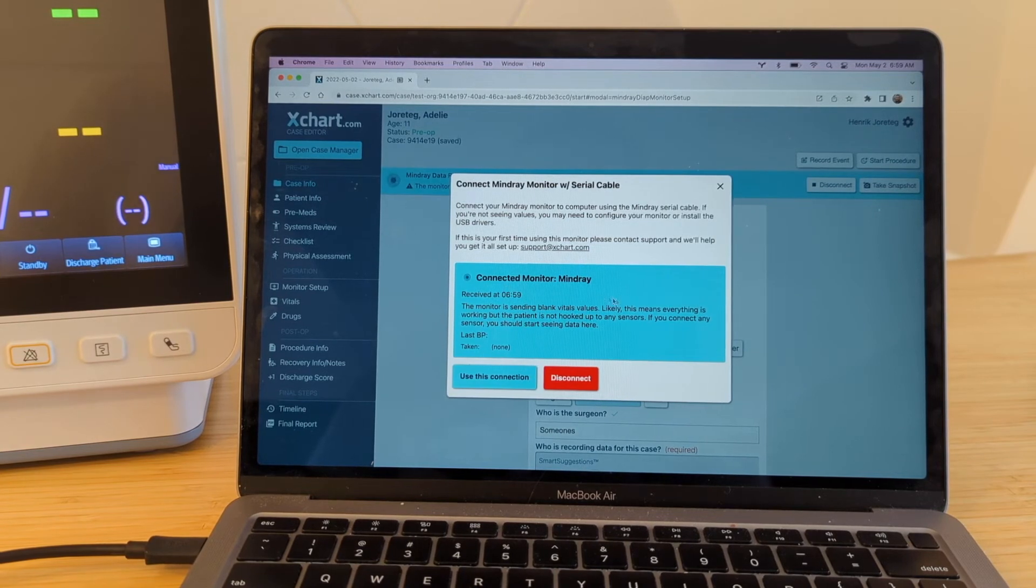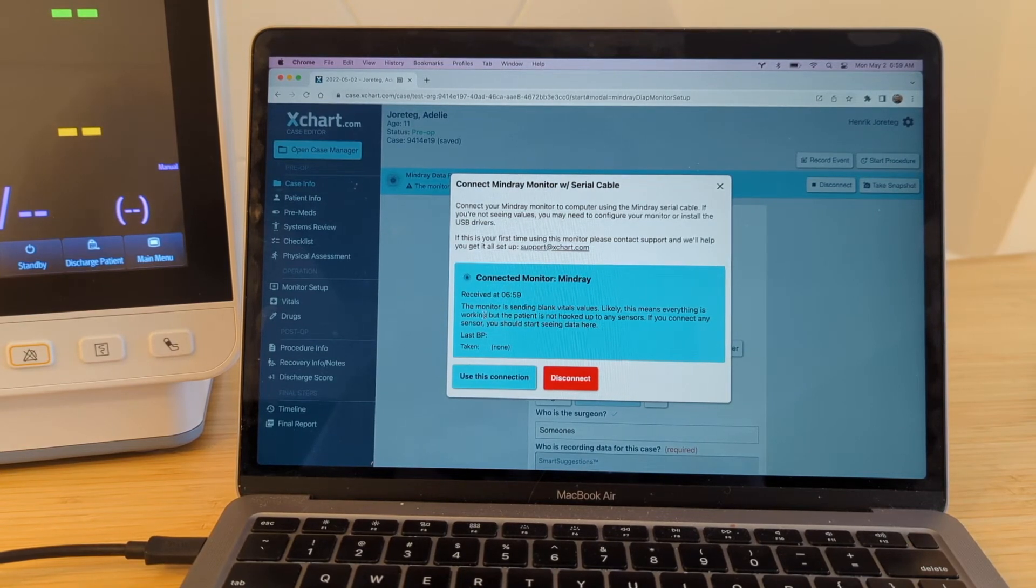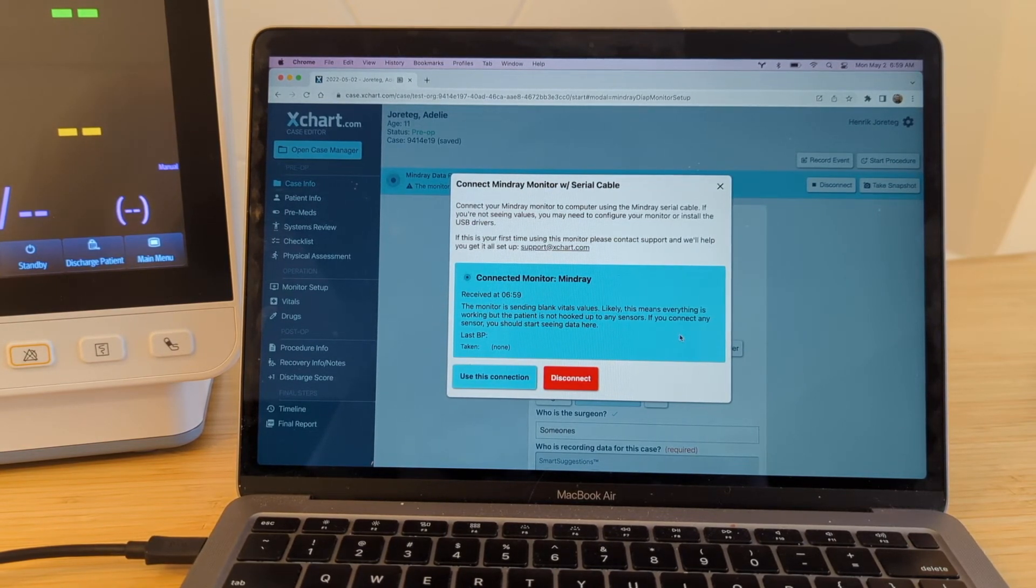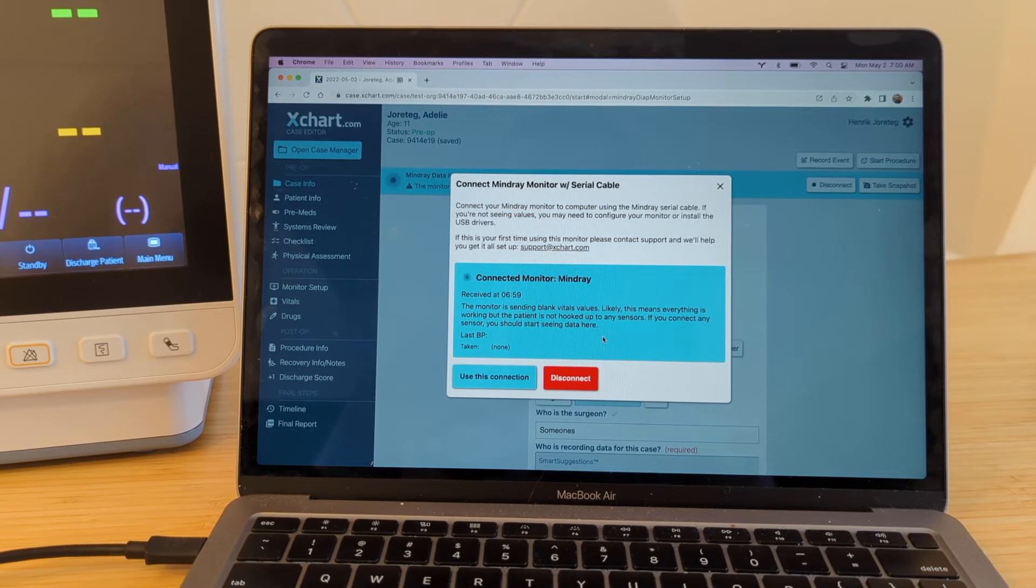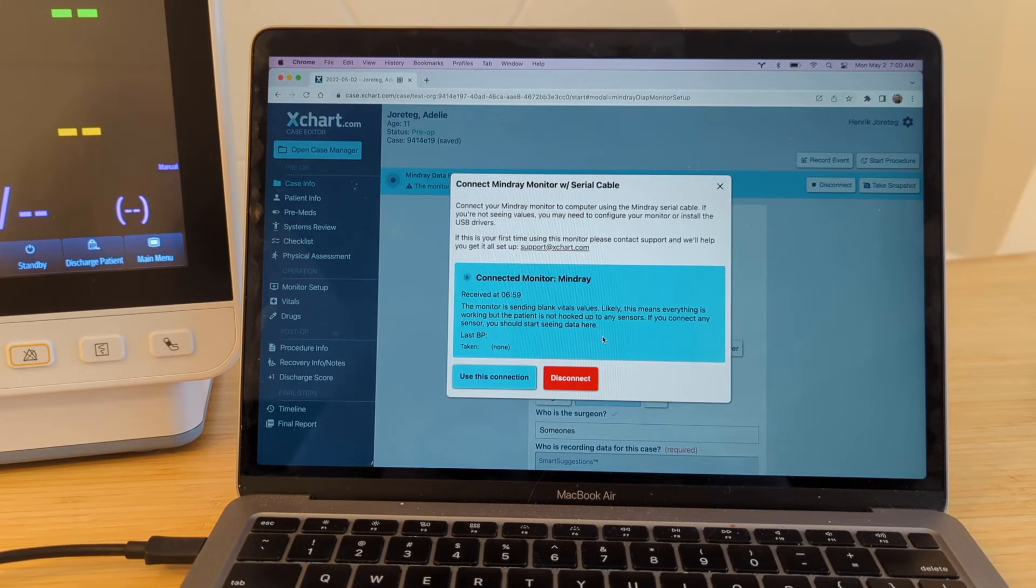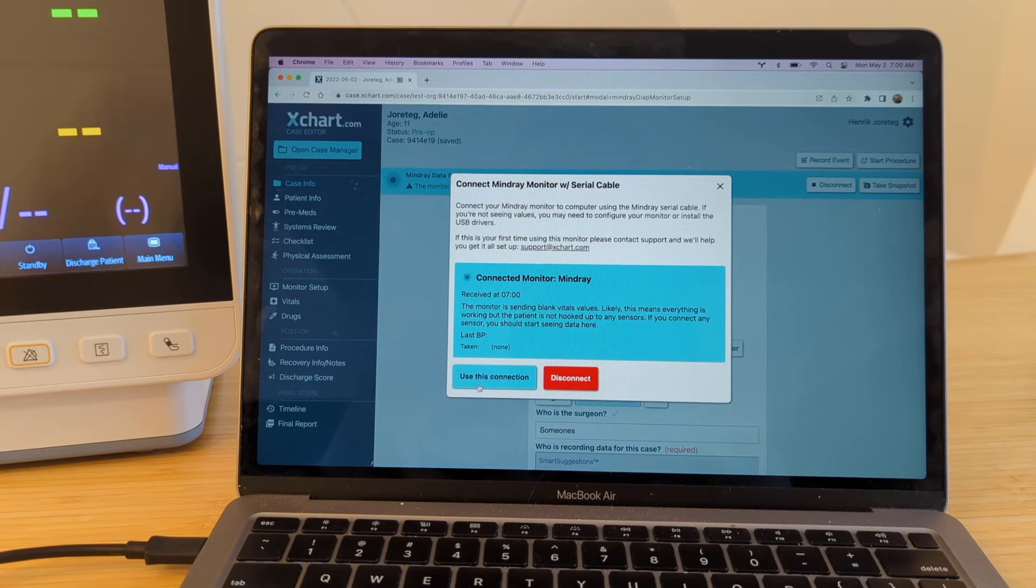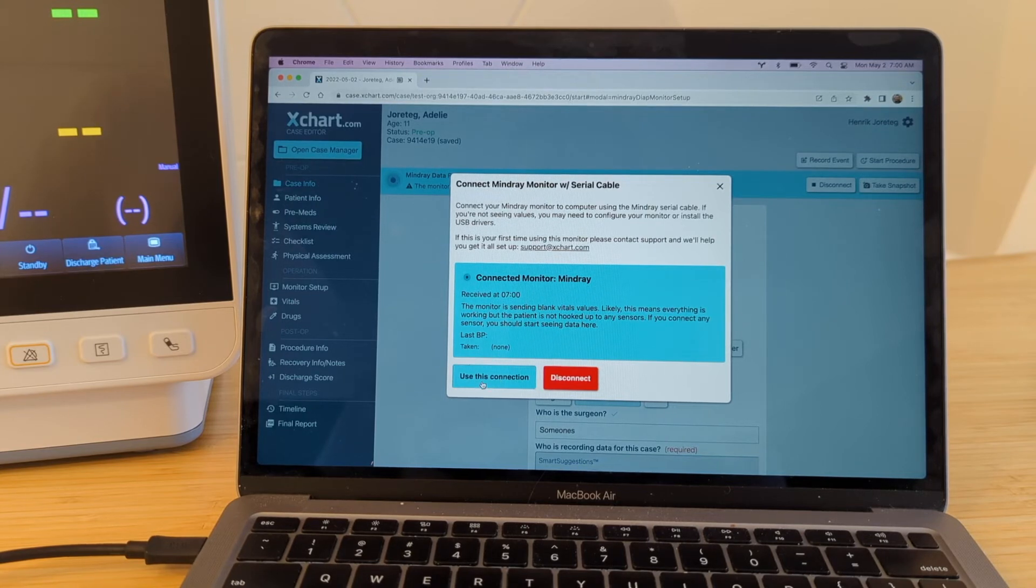And now it's connected. It's just saying the monitor is sending blank values. Likely this means everything is working, but the patient is not hooked up to any sensors, which is in fact the case here. I'm going to go ahead and say just use this connection. Now you can actually leave it in this state. You see the blue bar here at the top shows us that we have an active connection to the monitor.